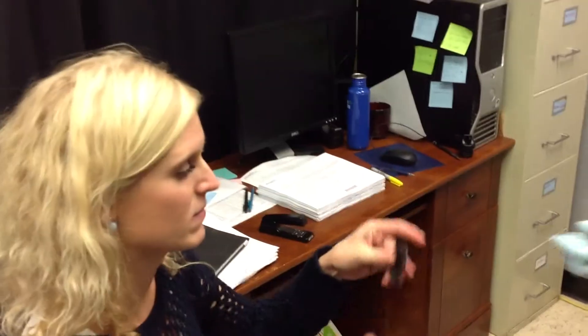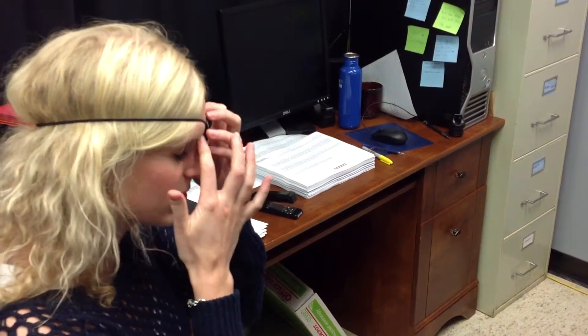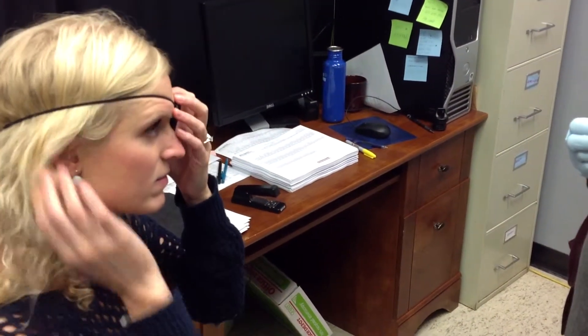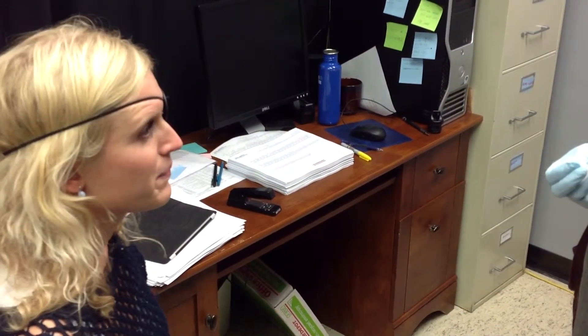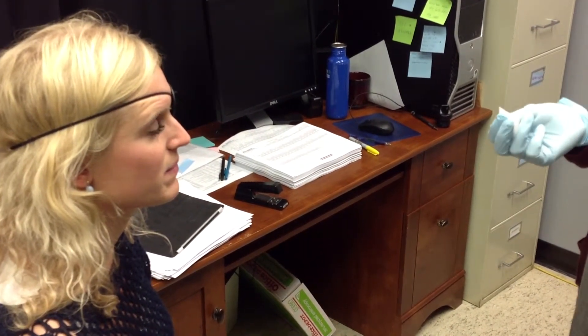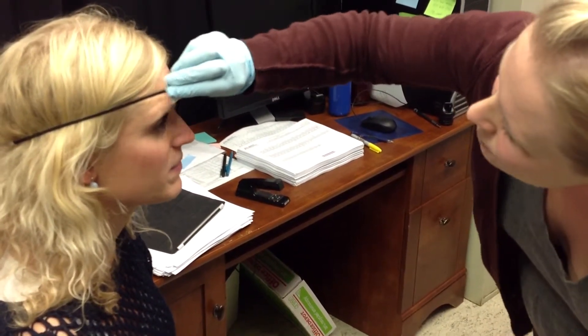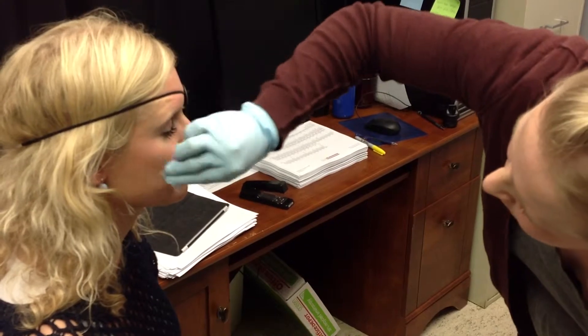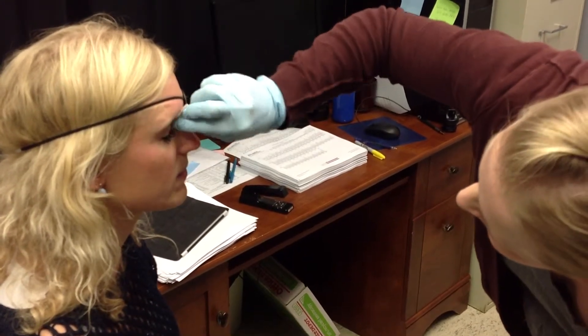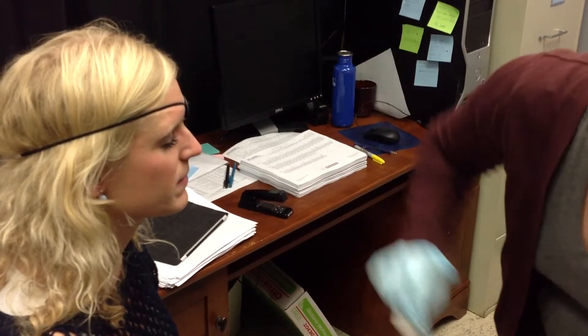Let's put the electrode on. I'm going to have you wear this eye patch over your left eye so that when you're looking through the eyepiece with your right eye you're able to focus on that spot, and you can keep both eyes open really wide. Now I'm going to wipe around your eye with this alcohol pad — this just gets a nice clean surface for the electrodes. Close your eye for a second so we don't sting you, and just keep your eye closed for about the count of five while the alcohol evaporates off.